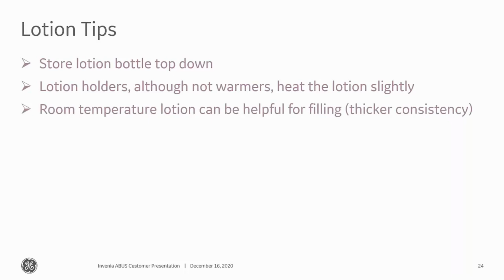Room temperature lotion can be helpful for filling in areas, and it has a thicker consistency. So sometimes those areas where you want to have a good buildup, you want that lotion to be more viscous, so to speak, then you would use a room temperature lotion.